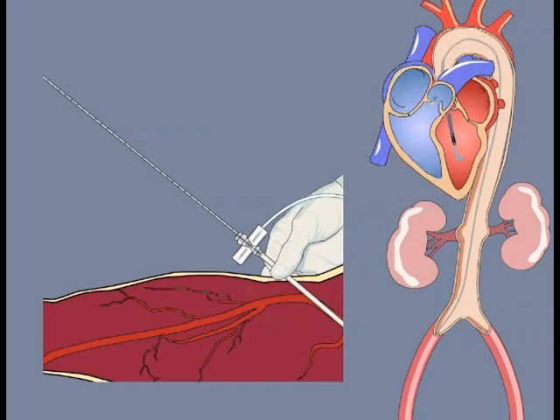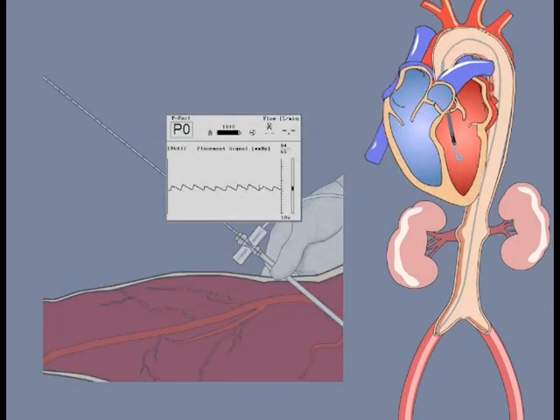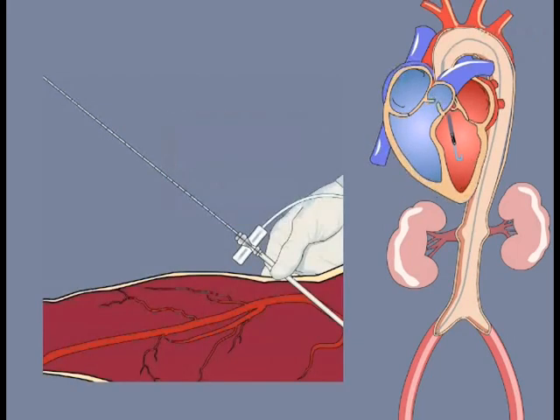The Impella console should display an aortic pressure tracing. To prevent device failure, do not start the Impella 2.5 catheter until the guide wire has been removed. After removing the placement guide wire, start the Impella device.